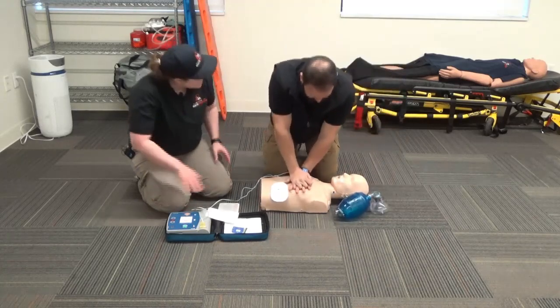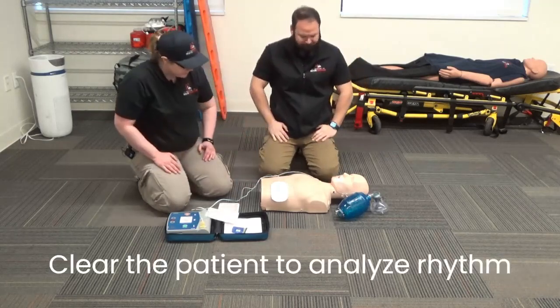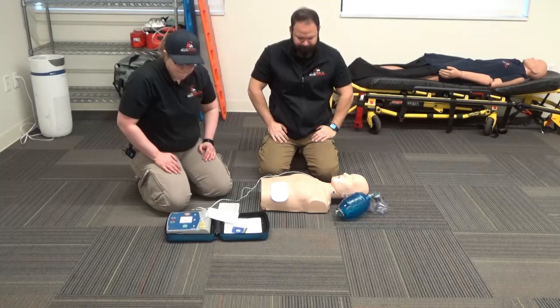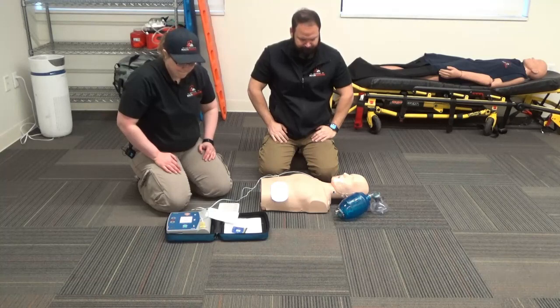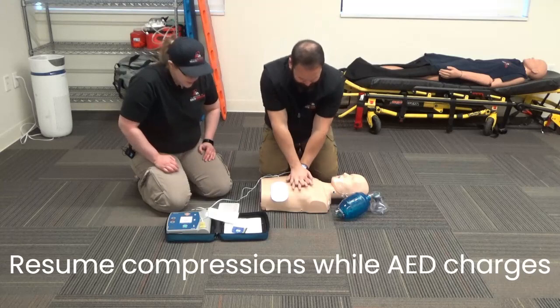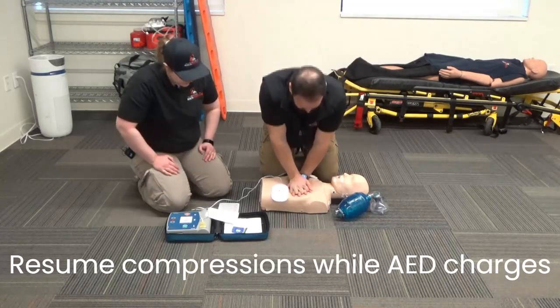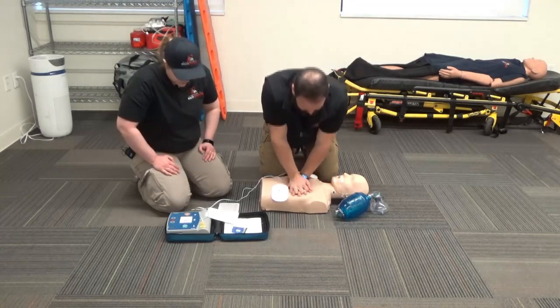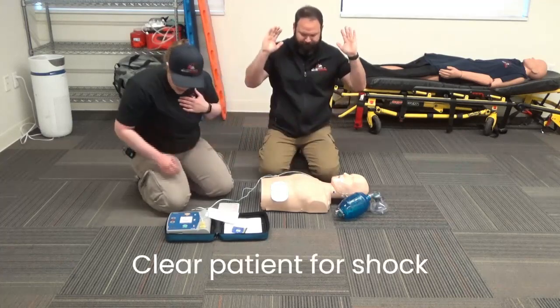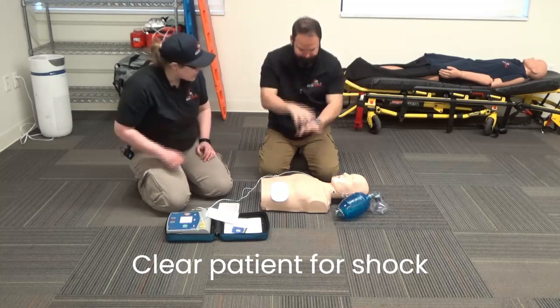Analyzing heart rhythm. Stop — stay clear of the patient, don't touch the patient. Shock advised. Continue compressions while it's charging. Shock delivered. Stop — stay clear of the patient. You're clear, I'm clear. Shock delivered. Resume compressions.